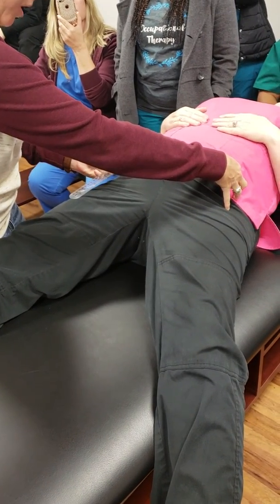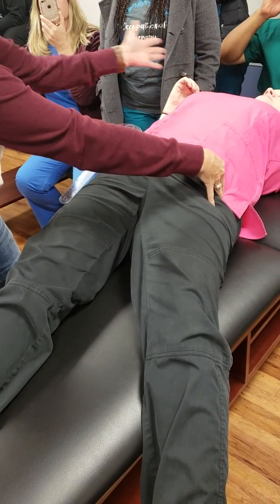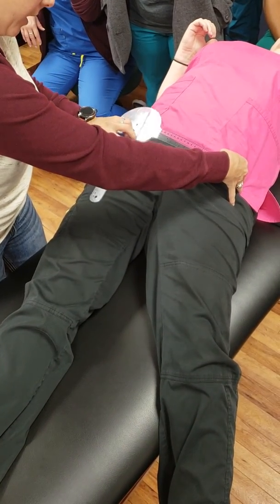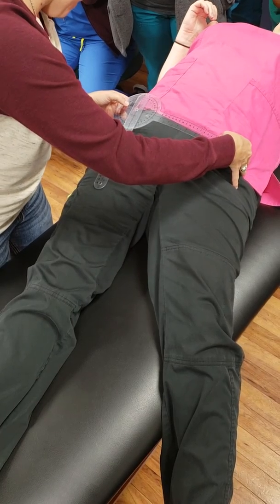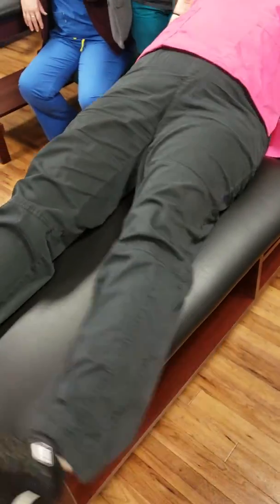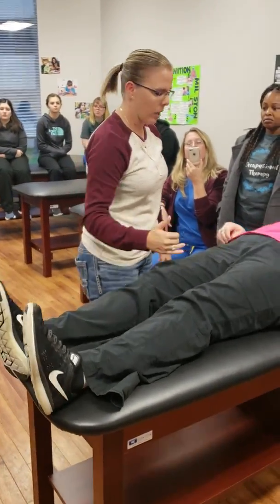You're going to have her come in without twisting and laterally flexing the trunk. We're not compensating by bringing your back up, arching your back. So then we go in again. That's all I got. There you go. We went from 0 to 16. Your abduction and adduction isn't a lot. So that's hip flexion, hip abduction, and adduction.